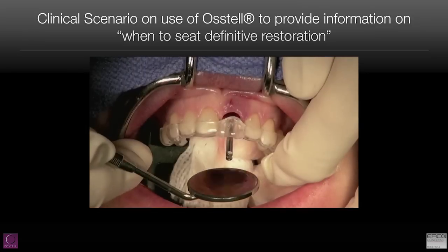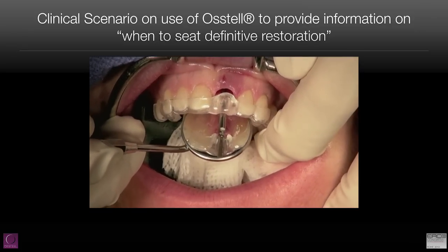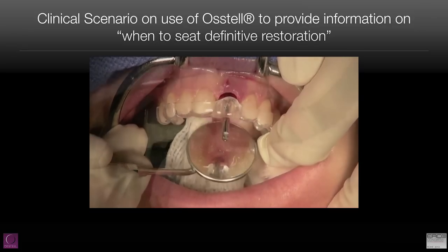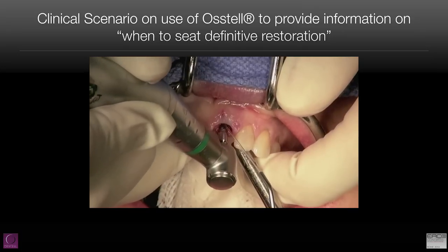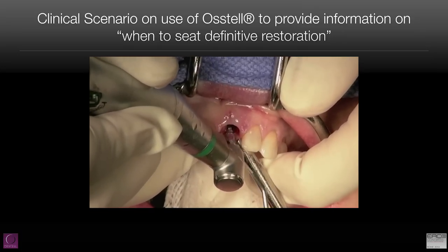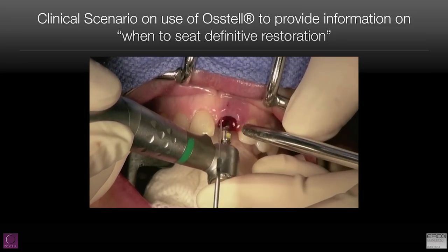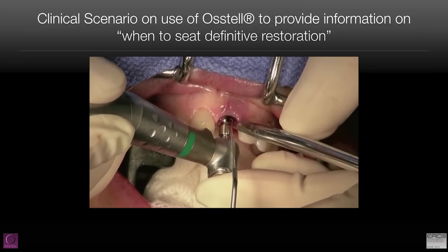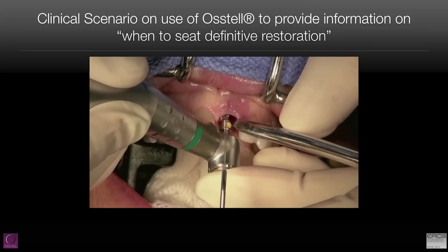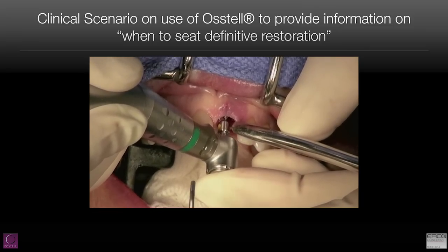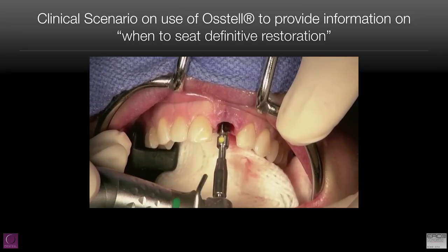For me, primary stability is the key, and this is how I determine that. By placing the preparation site more to the palate, we're able to engage that nice, dense bone on the palatal side. As you can see, the twist drill is struggling to get apposition onto the bone, because there is actually no labial bone whatsoever, as you saw with the pocket measurements. The key for me is to establish the proper shape and form in the preparation of the bone.